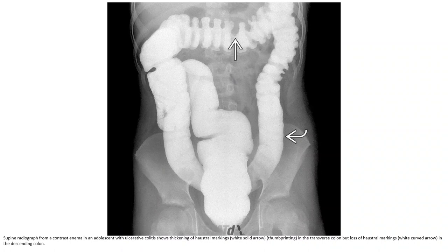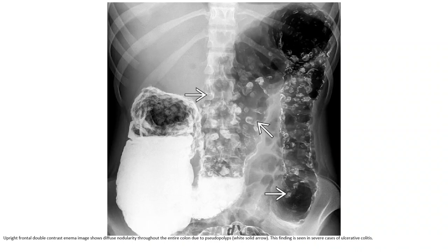Radiographs from a contrast enema in an adolescent with ulcerative colitis show thumbprinting in the transverse colon, but loss of haustral markings in the descending colon. The upright frontal double contrast enema image shows diffuse nodularity throughout the entire colon due to pseudopolyps. This finding is seen in severe cases of ulcerative colitis.